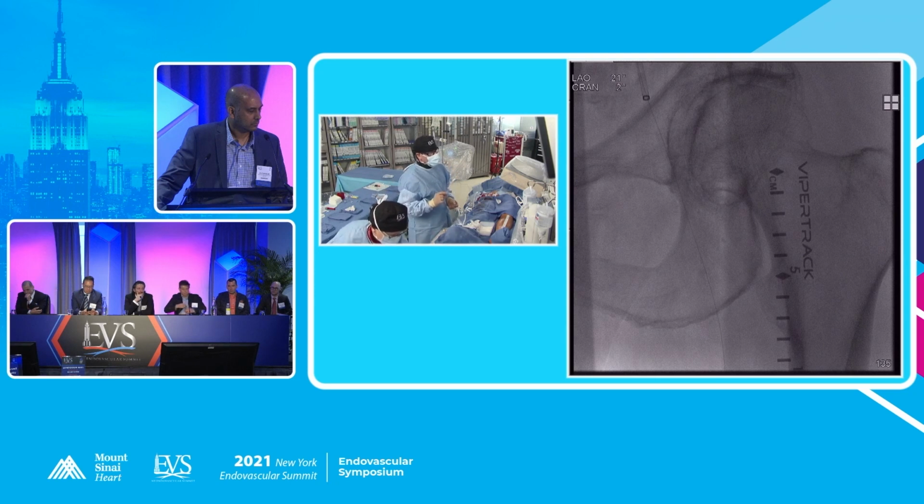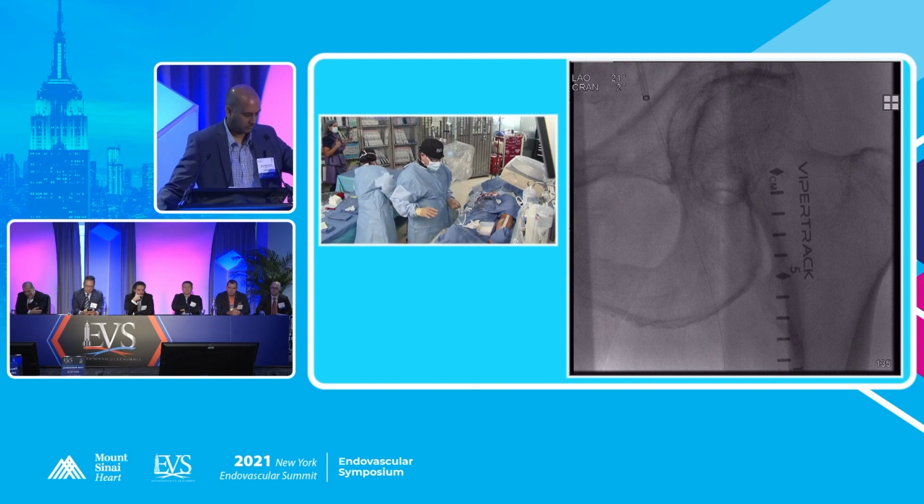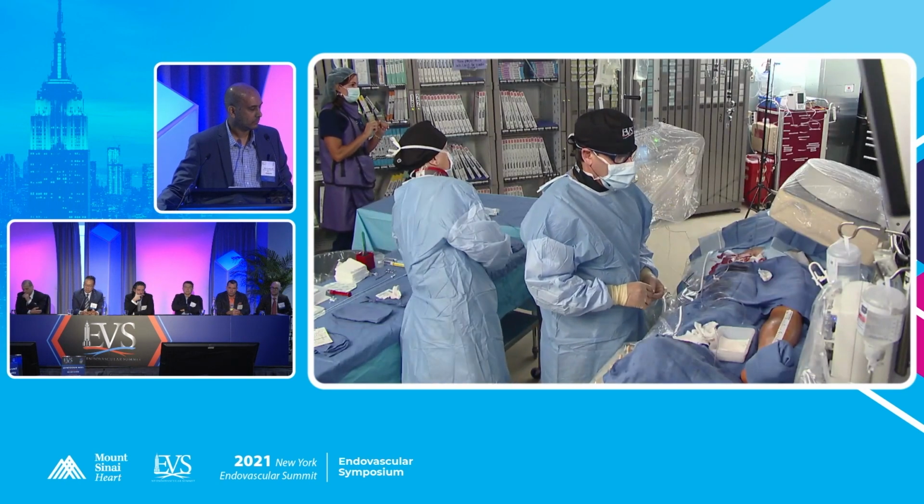I do think we have new technology. Let's take the 7x60 Shockwave. We're going to do the 7x60 Shockwave first. And then we'll Shockwave downstream if we need to, and then we'll put a drug-eluting stent if we need to. So anyhow, I think all good comments. We did discuss it with our vascular surgeons. I promise we discussed it with the patient.